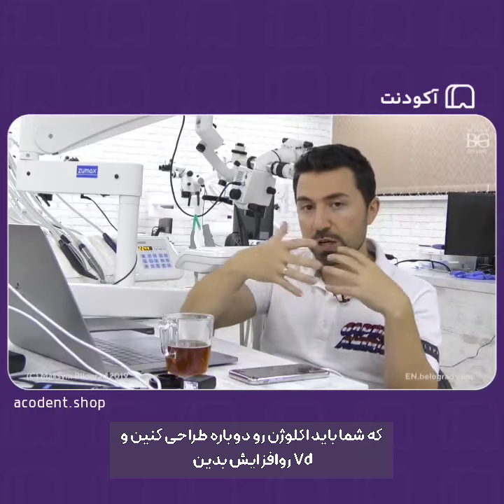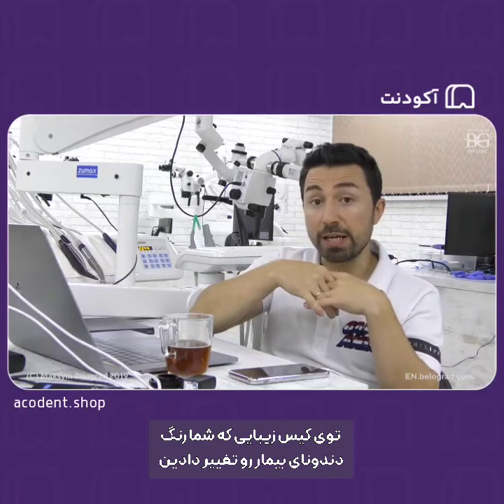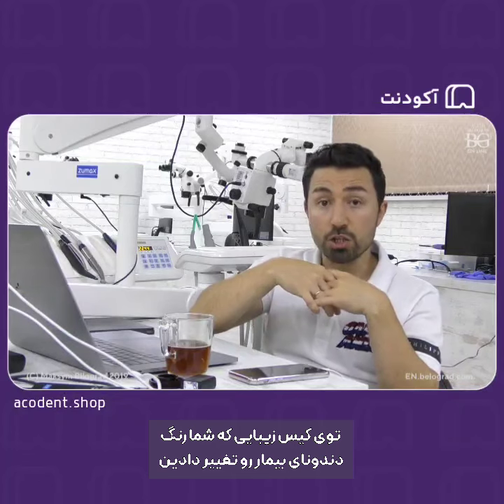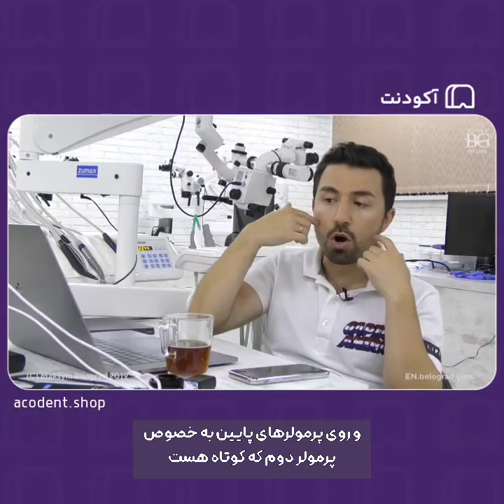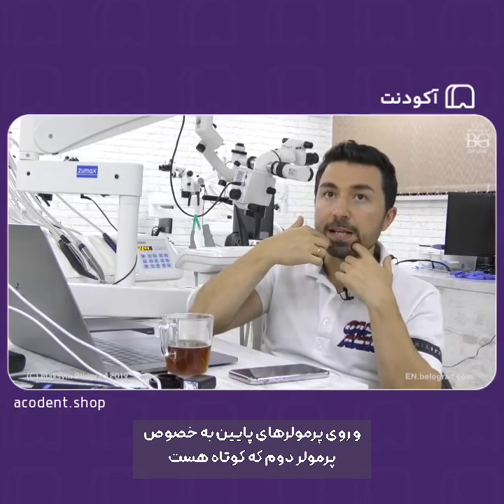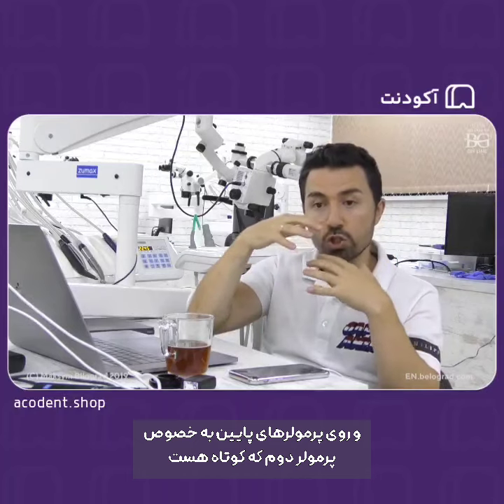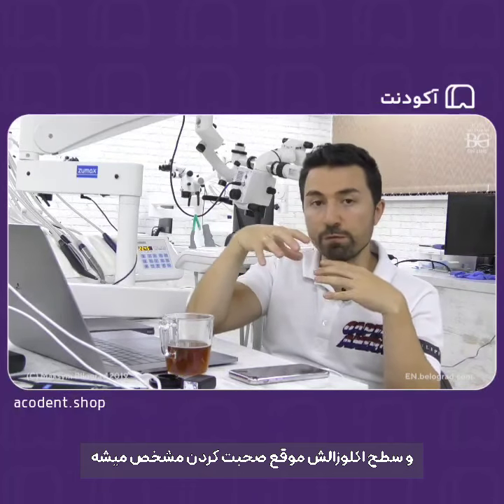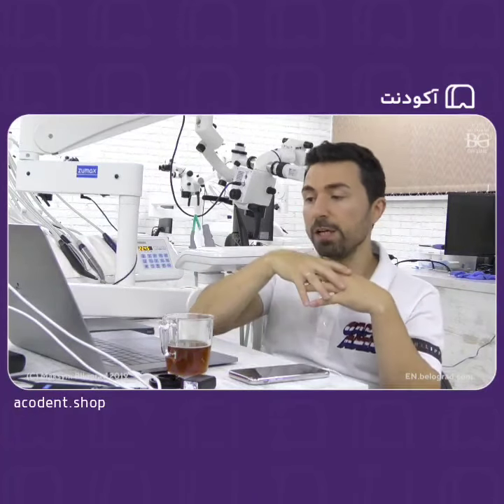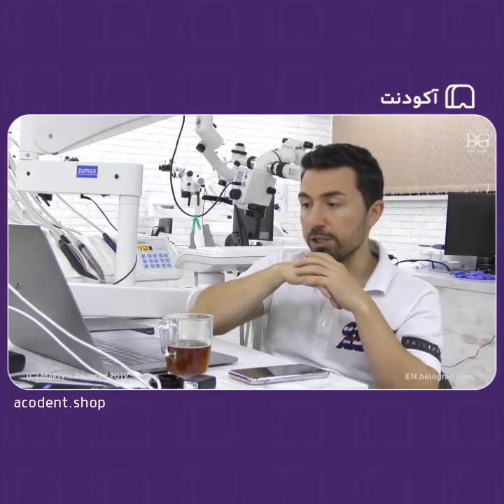So in this case, we cover the occlusal surface. Another option, you have an aesthetic case and you change the color of the patient's teeth and you work on lower premolars, especially the second lower premolar, which is short, and you can see the occlusal surface when the patient speaks. In this case we will cover the occlusal surface because of the color change.